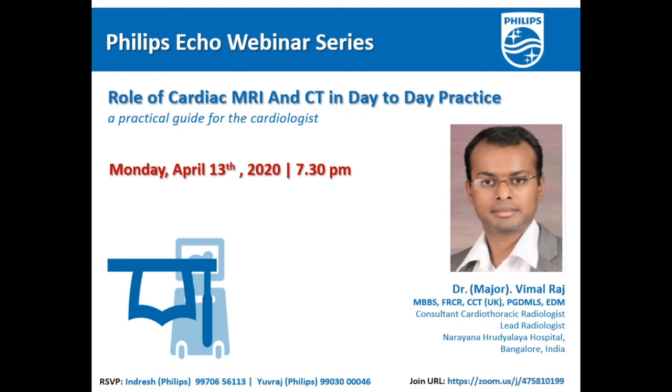Bedside portable MRI have come along with CT of head. Any role in cardiology? Vinod, very nice question. No, the bedside portable MRI, which has come for brain, is a much smaller machine, and it is capable of doing small field of view areas. For cardiac MRI, I do not expect it to come for at least the next 5 years, maybe 5 to 10 years time. There may be something where we can do a portable one.